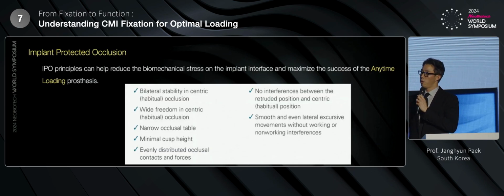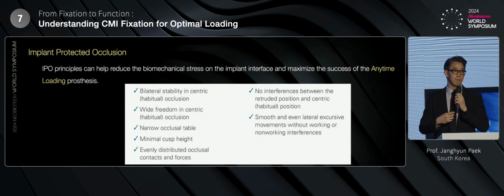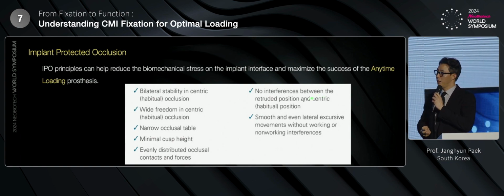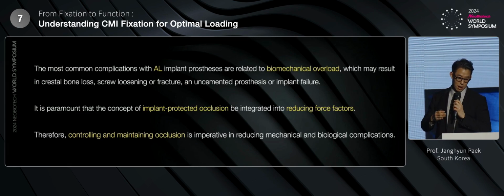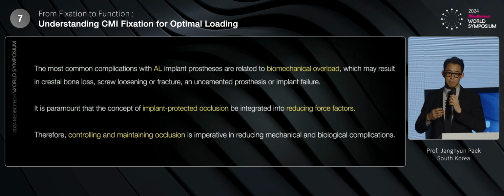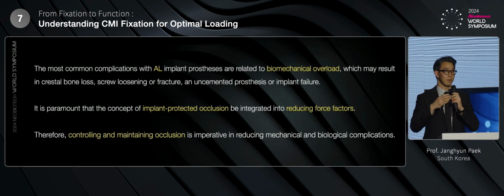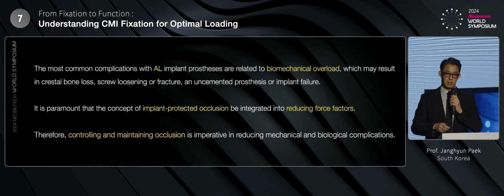So we have to come up with the idea of implant protected occlusion. We have to protect our newly placed implants by utilizing these concepts that I already told you. The most common complications with anytime loading prostheses are related to biomechanical overload. And it's paramount that the concept of implant protected occlusion be integrated in reducing force factors. Controlling and maintaining the forces and occlusion is of foremost importance.